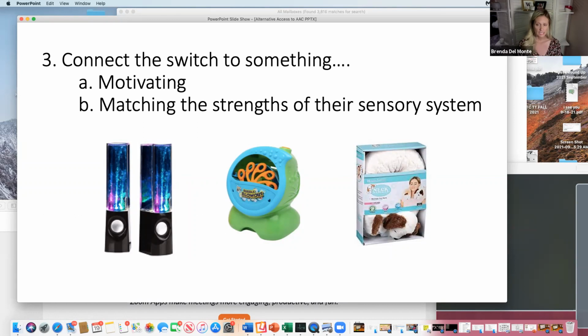But other options are things like this vibrating pillow on the right. And I don't know what we're doing with pillows, because with COVID and everything, it's a really hard thing to wipe down and keep clean. But it's a good and fun toy. This comes out of Walmart every year, and we have a toy giveaway that we do here in Arizona. No matter how many of these we adapt every year, we give them all away, because hitting a switch and feeling something vibrate and then coming off the switch and having that stop is better than 1,000 words of explanation for a child.